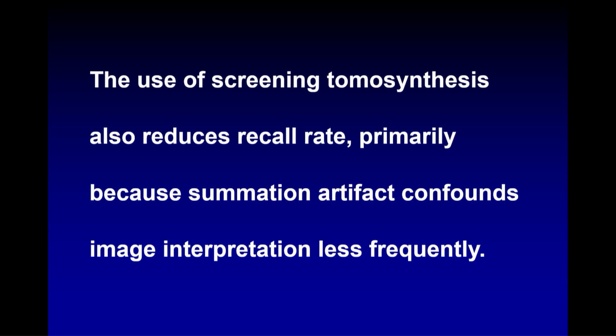Tomosynthesis also reduces recall rate. And a good deal of the recall rate reduction comes from identifying summation artifacts, these one-view findings. You see the one-view finding, you go to the tomo stack, and you look through them frame by frame, slice by slice, whatever you want to call it. And when you get to that area and you go through it, you just see that it's just superimposed tissue and there's really nothing there.